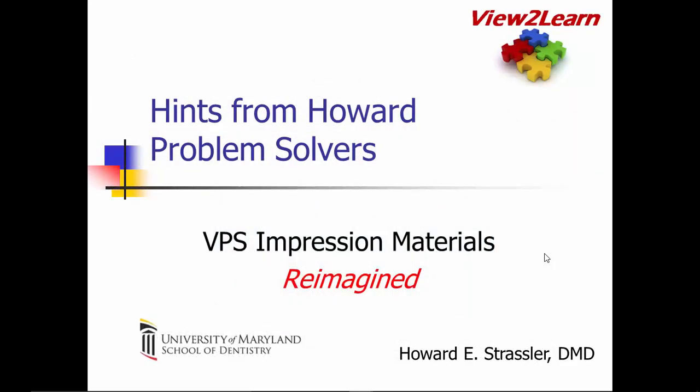So you've been watching a Hints from Howard, a problem solver, where we've been looking at VPS impression materials reimagined, using them for other uses beyond just making impressions.